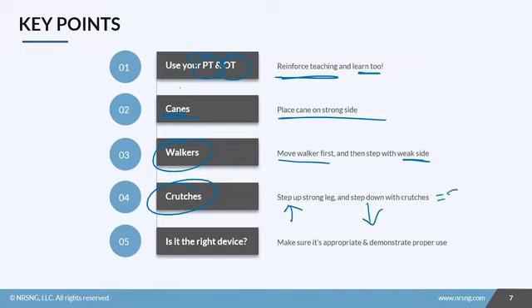This is really focused on safety. Last but not least, make sure that your patient is using the right device. Make sure they're using the right mechanical aid, and make sure they're also using it safely and that they can demonstrate that they can use it.